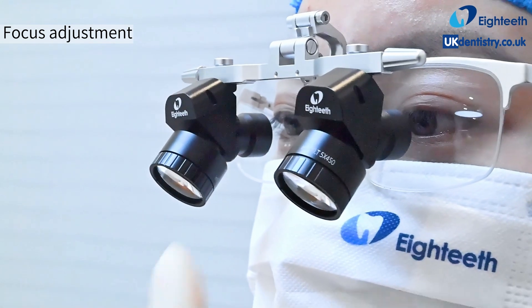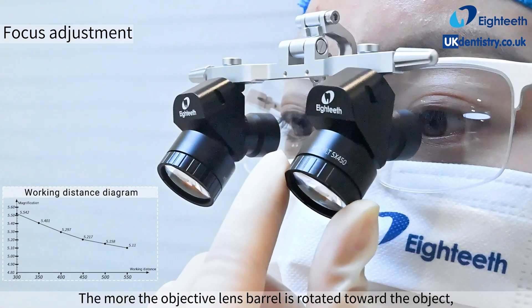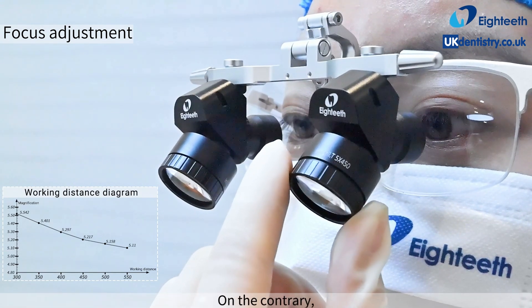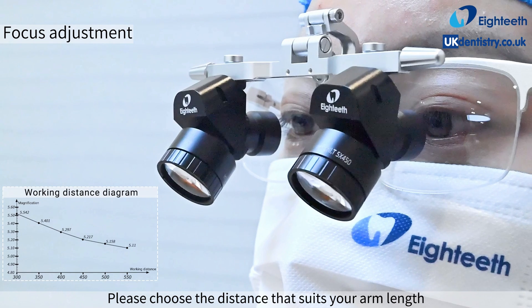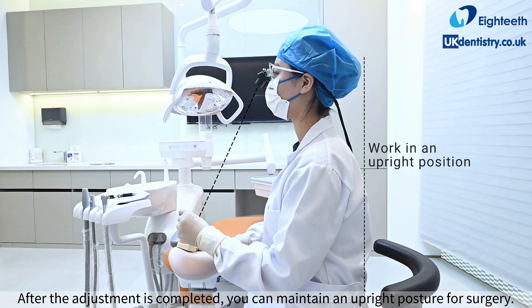The more the objective lens barrel is rotated toward the object, the closer the working distance will be and the magnification will increase. Conversely, the farther the working distance, the smaller the magnification will be. Please choose the distance that suits your arm length. After the adjustment is completed, you can maintain an upright posture for surgery.